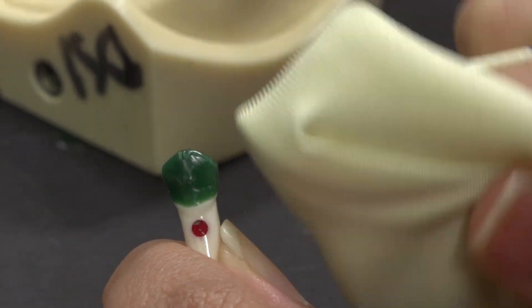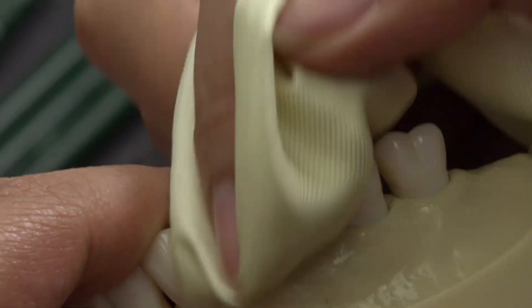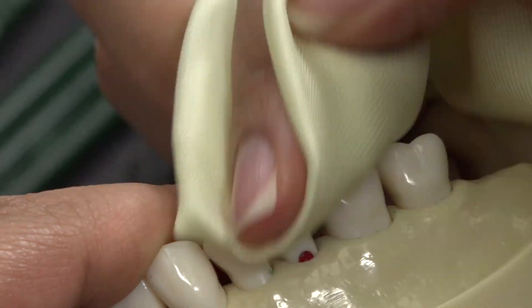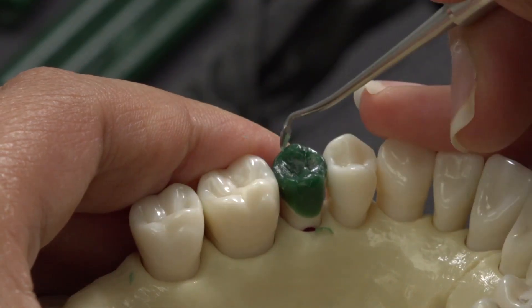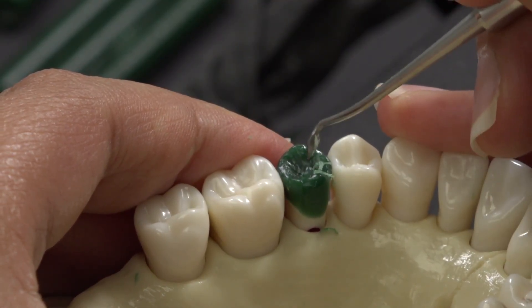I then use silk to polish it even more. I use carver 3 and a hot PKT to refine the occlusal even more.